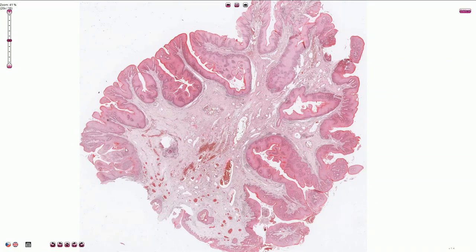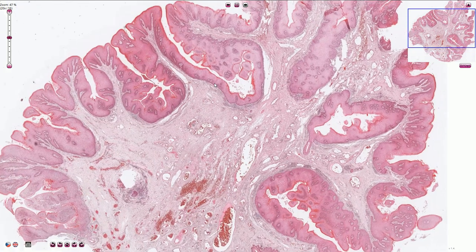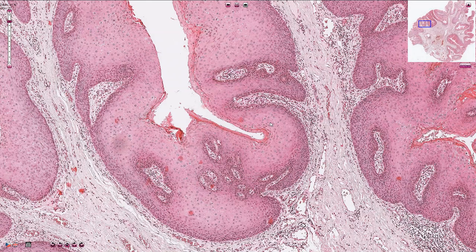Under the microscope we can see papilloma-like polypoid structures lined by acanthotic stratified squamous epithelium. Acanthosis is the term used to describe the thickening of the epidermis. These papillary structures have prominent fibrovascular cores, and on higher magnification we can see the acanthotic stratified squamous epithelium with a well-circumscribed basal layer which creates slightly bulbous prominences.